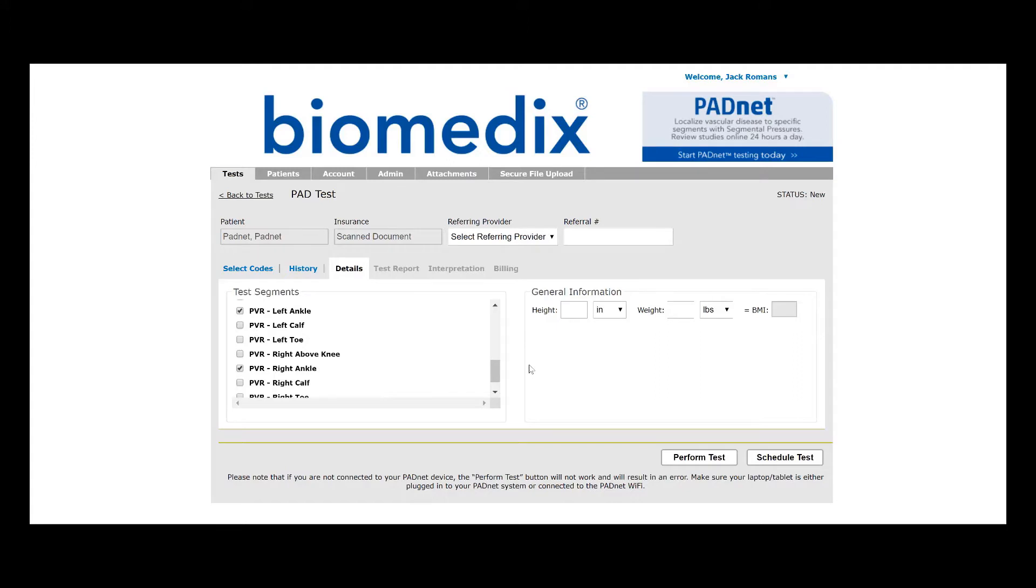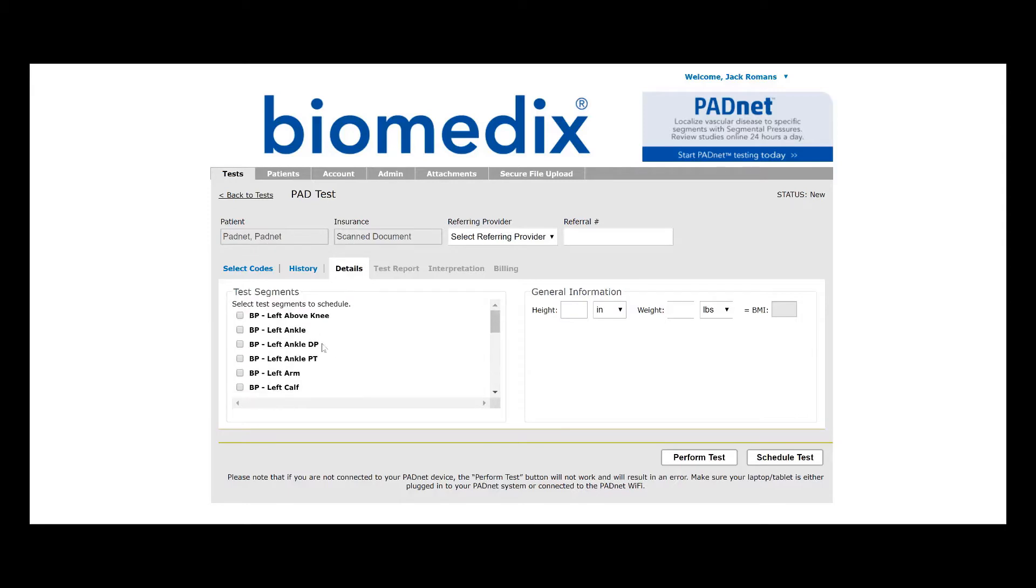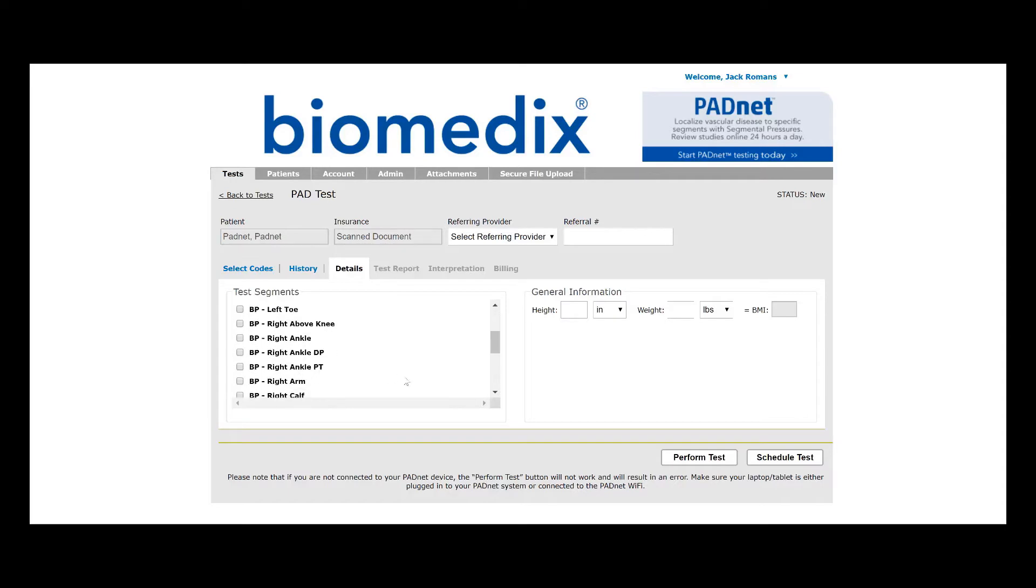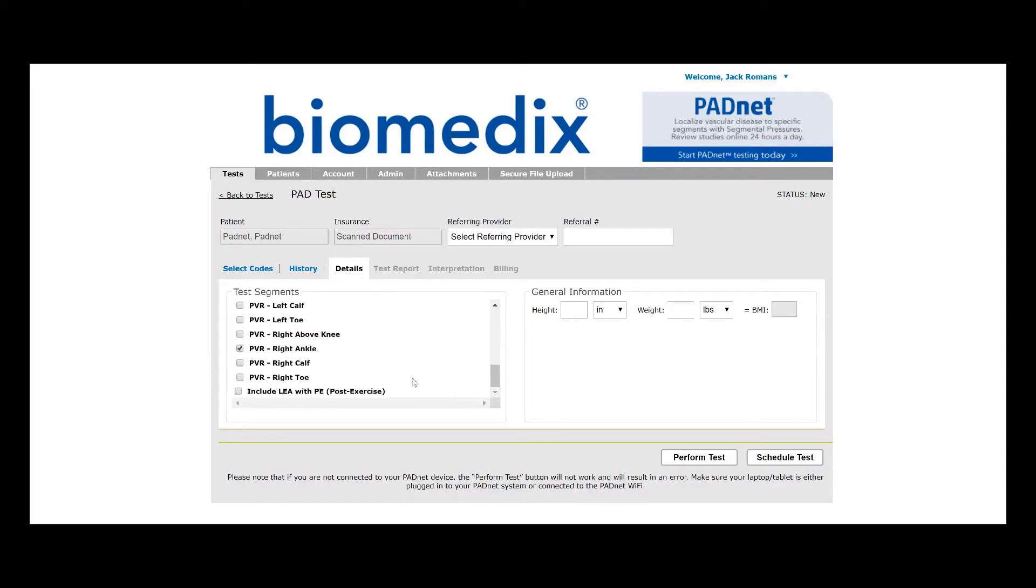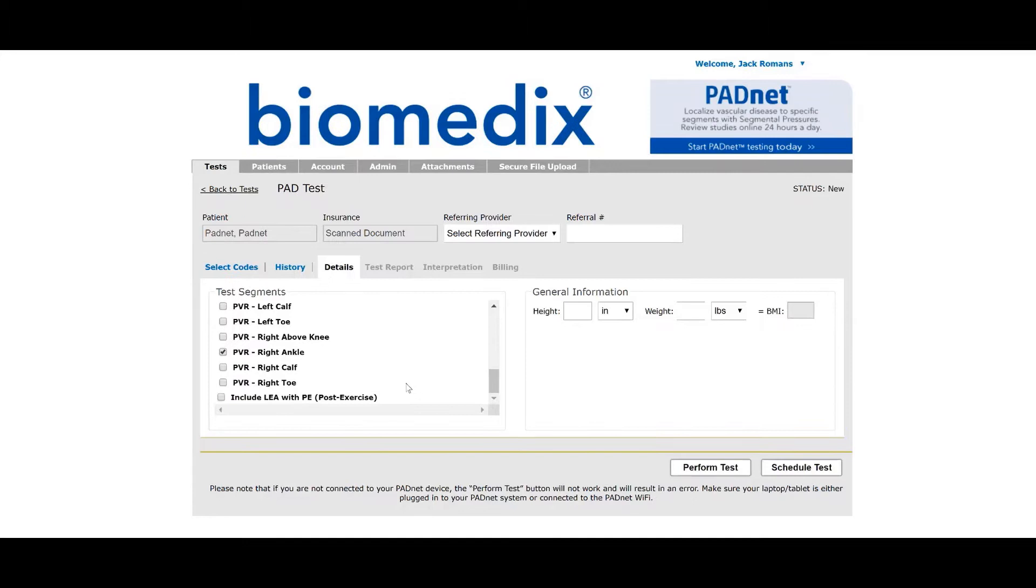If your office is interested in also including the ABIs, you can scroll up and add the appropriate blood pressure test segments, but for our intents and purposes, we are just going to leave it with the PVRs in both ankles. If you selected 93923, you can go ahead and deselect all other segments, leaving behind just PVR in the right and left ankle.